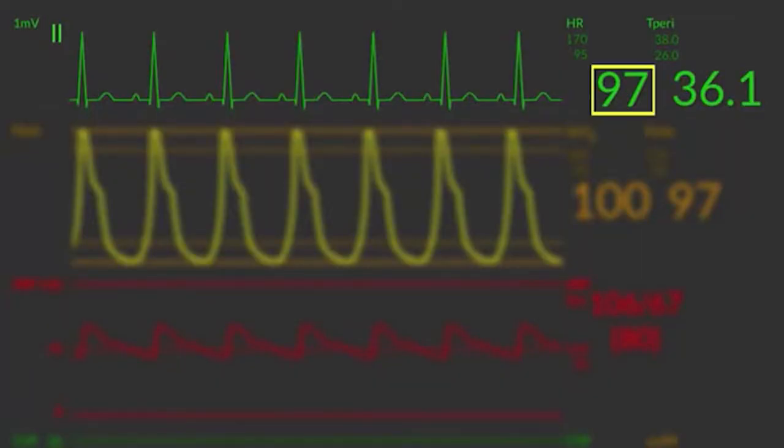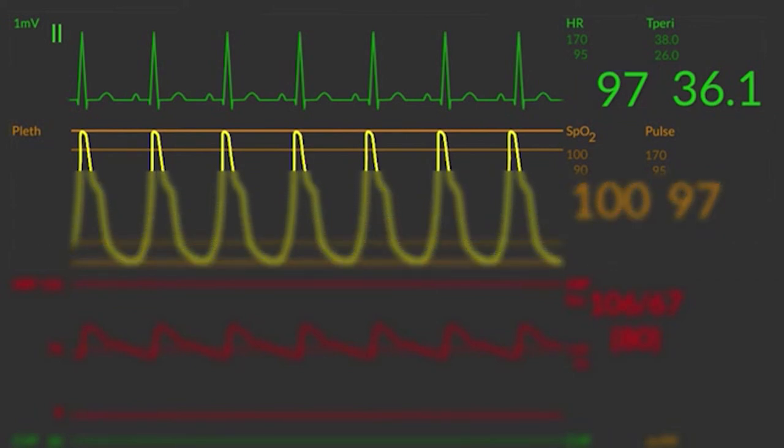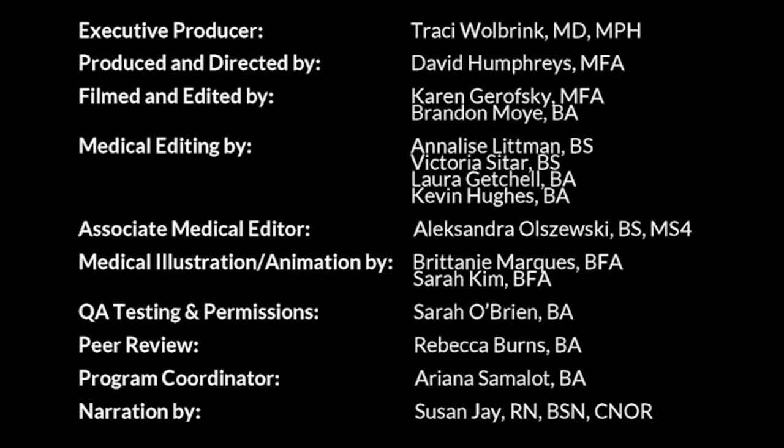Overall, as you assess your ECG tracing and heart rate, take note of two things: the heart rate shown as the green number at the top of the screen, which should correlate to the pulse shown as the yellow number from your oxygen saturation probe; and your patient's ECG rhythm, trending to ensure they are in normal sinus rhythm or identifying any new onset arrhythmia requiring intervention. Please help us improve the content by providing us with some feedback. Thank you.